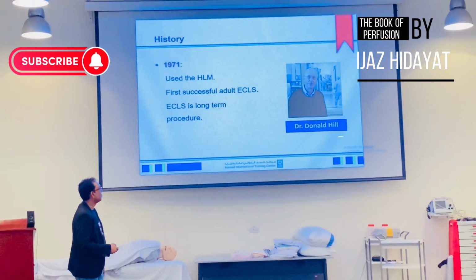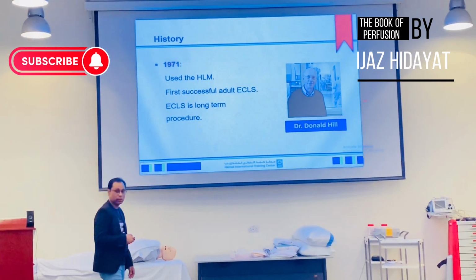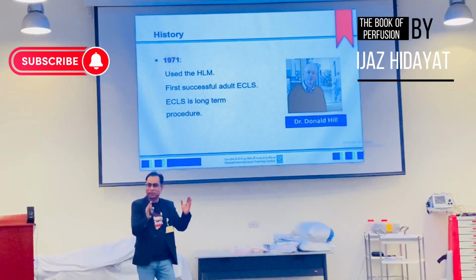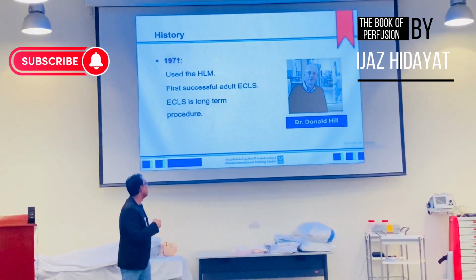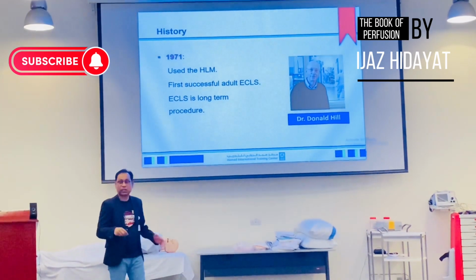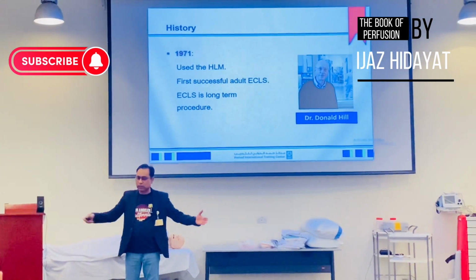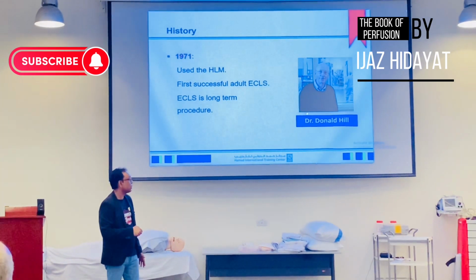1971, Dr. Donald Hill. See, he used the heart-lung machine. So in the beginning, in my first slide, I mentioned ECLS and I mentioned ECMO. So the first was your ECLS, extracorporeal life support. The same machine for the long-term runs. So he experimented to keep the patient on the heart-lung machine.